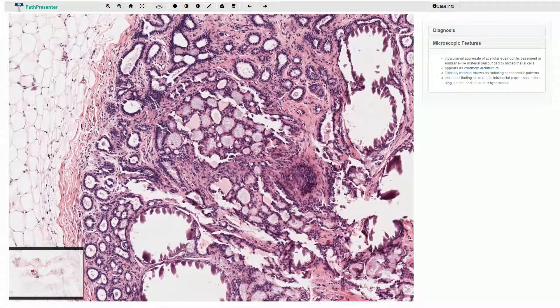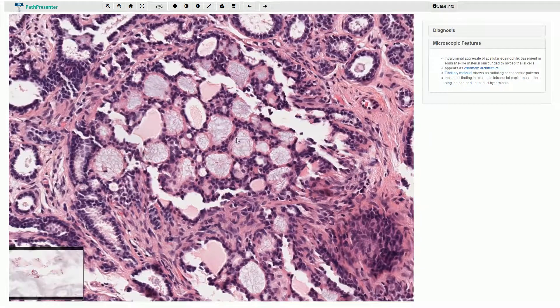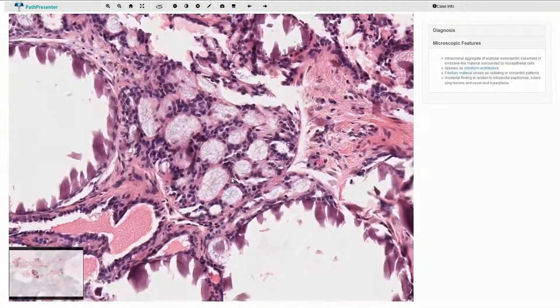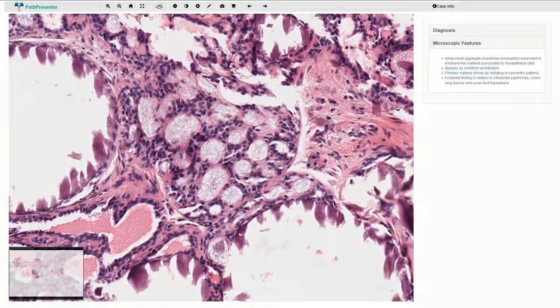Here we can see this cribriform structure with intraluminal aggregate of acellular eosinophilic basement membrane-like material which is surrounded by these myoepithelial cells. Here we have another focus. The intraluminal material is typically fibrillary and it shows a radiating pattern, with strands that radiate from the center to the periphery of the lumen.